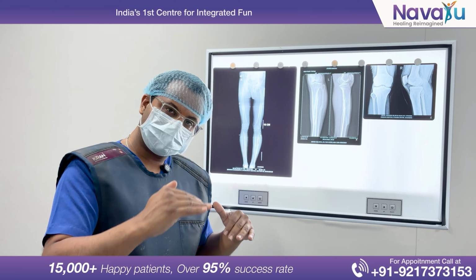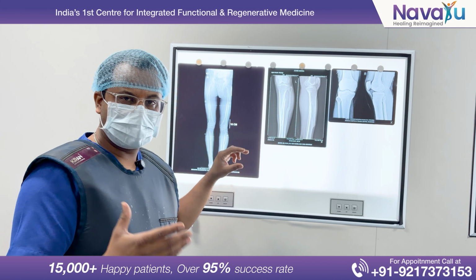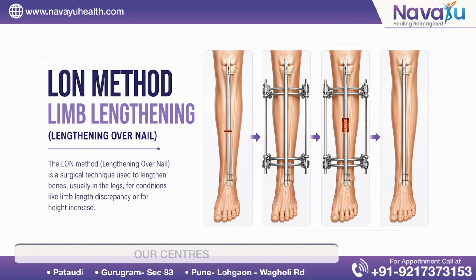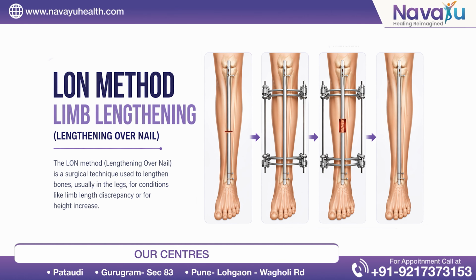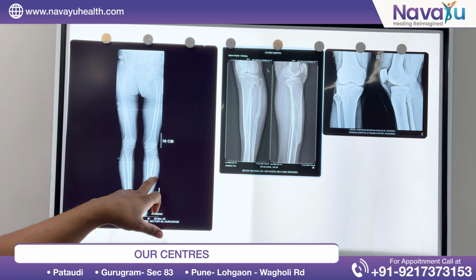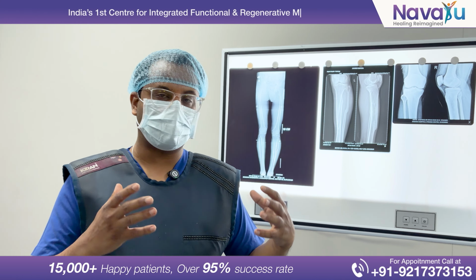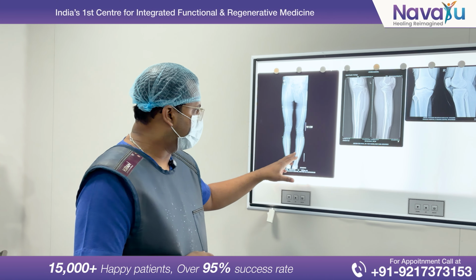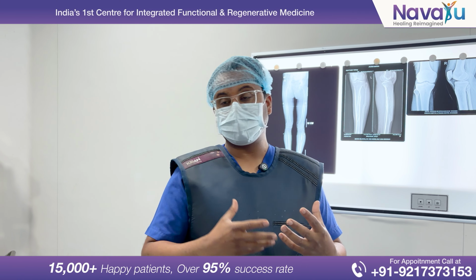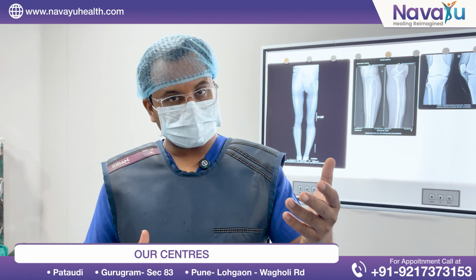Here we need to do both things. First, we need to correct the deformity. After deformity correction, we are planning to go for the LON method. We will try our best to go for the LON method. Many times, if there is a very old fracture and there is no canal, then we need to change our plan. So here we are planning to go for deformity correction first. We will go for the fibula osteotomy and then we will make the cut at the CORA, the point where there is a deformity intersection, and then we will try to put the LON. This is how we handle limb-length discrepancy with deformity, going for deformity correction as well as lengthening.